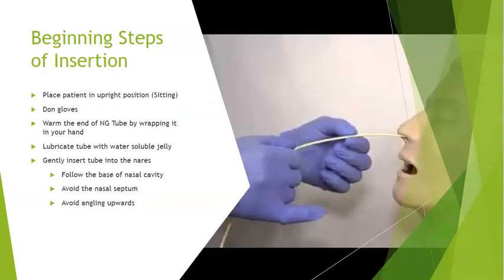Now this is where we're going to begin the steps of insertion. We're going to place the patient in an upright position. You want them in a sitting position. You're going to don your gloves.